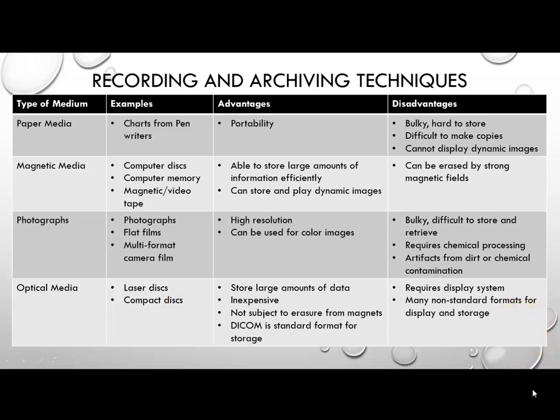So if you've ever taken a DICOM file set and tried to display it on a PC, you'll quickly find that a normal PC will not display DICOM information. So there are, unfortunately, many non-standard formats for display and storage. I have some optical media for old GE Logic systems. They weren't even Logic, they were L100 systems, and I can't display that information because it's all on optical media that is non-standard. So that's a problem.